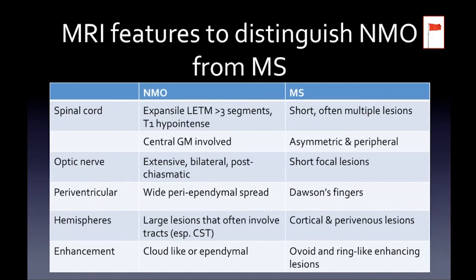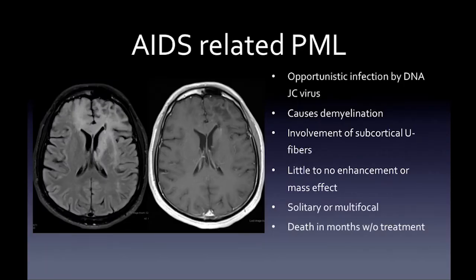MRI features distinguishing NMO from MS: in NMO the spinal cord is expansile, usually greater than three segments, involving the central gray matter. The optic nerve involvement is usually extensive, bilateral, and post-chiasmatic. Periventricular lesions are wide and hazy ependymal lesions, as opposed to the focal Dawson fingers of MS. The enhancement pattern in NMO is cloud-like or ependymal, versus the peripheral ovoid ring-like enhancing lesions of MS.